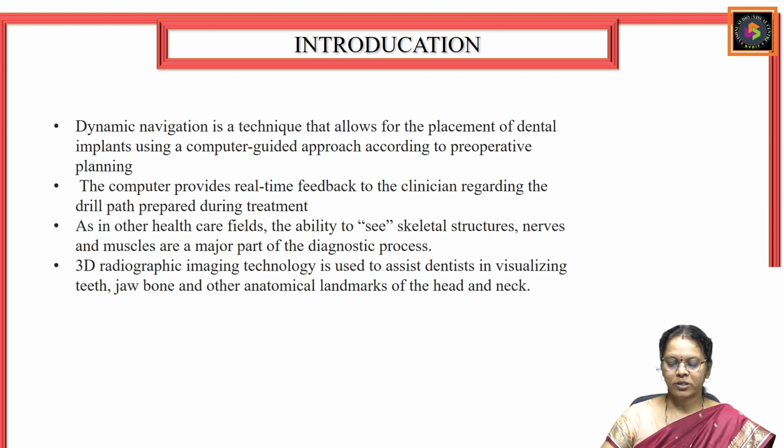In other healthcare fields, the ability to see the skeletal structures and the internal structures becomes very difficult, and this is another area where the dynamic dental navigation system helps to visualize the internal organs of the body. It provides 3D radiographic imaging of the internal surgical sites, which assists the dentist to visualize the internal dental structures such as teeth, jaw and other anatomical landmarks of the head and neck also.